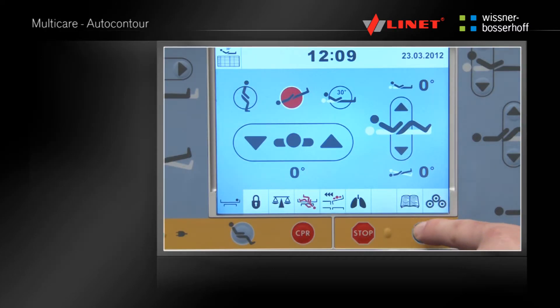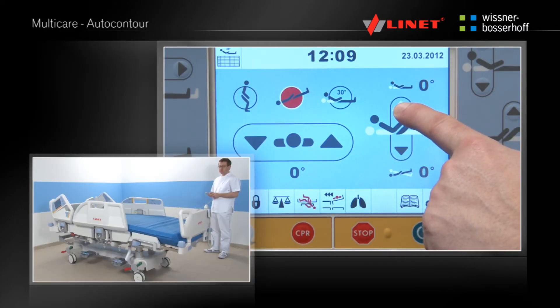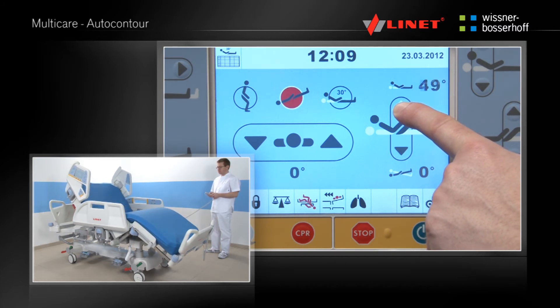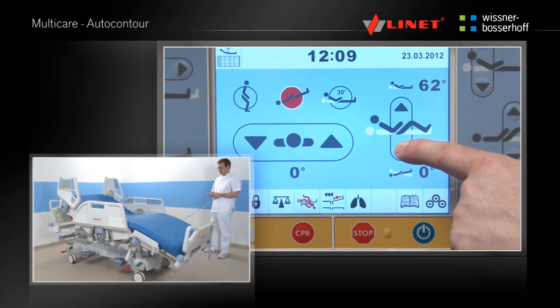Activate the function by pressing the Go button. Press and hold the function button until the desired position is reached. Auto-contour means the positioning of the thigh rest and back rest simultaneously.